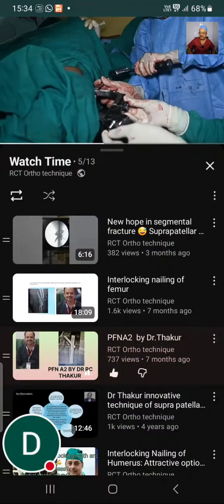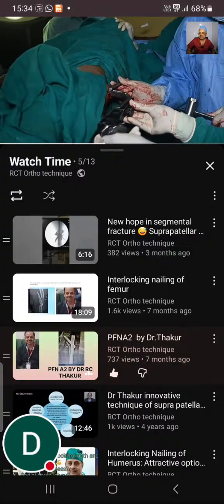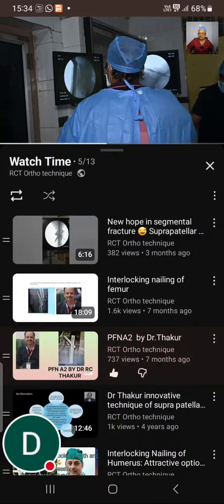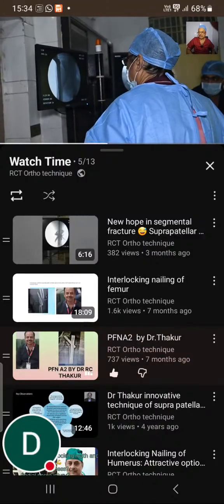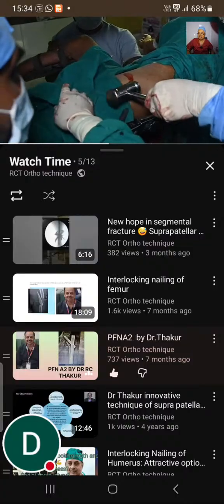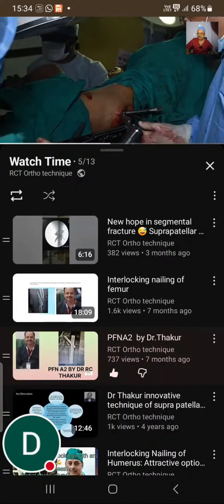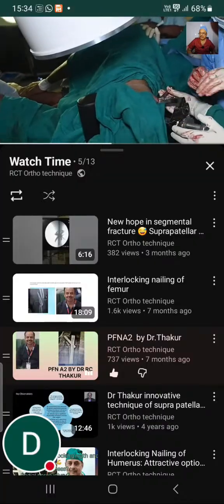I am hammering the nail inside the intramedullary canal so that the hole present in the nail comes in the central position of the neck of the femur in every view, and the spiral blade can be introduced.